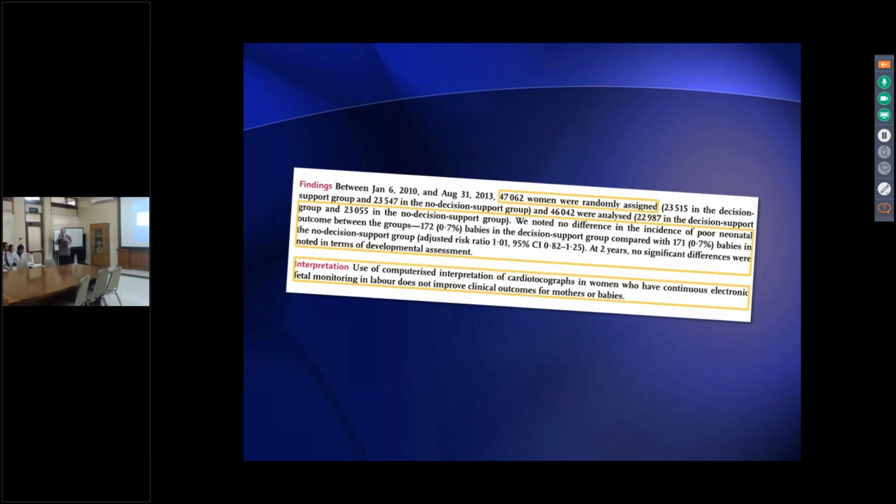And some of the most important pieces of information you need to know, in my view, during labour, when you see CTG, are two things. What is the mother's parity? So has she had a vaginal birth before? Because that influences the time frame dramatically. And number two, what stage of labour is she in? Is she first stage 3-4 centimetres, or is she fully dilated? Because that changes your decisions. The computer can't tell that. The computer can't process the stage of labour, her parity, contractions.